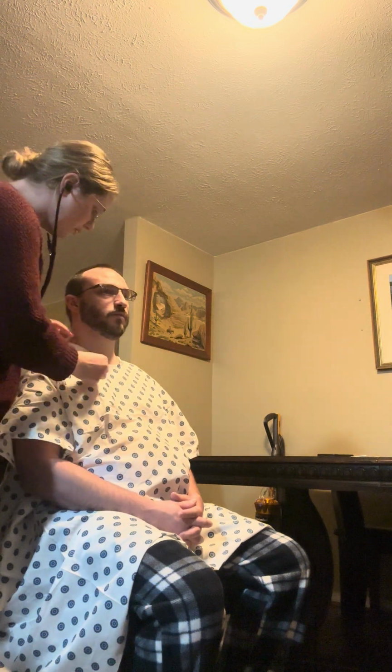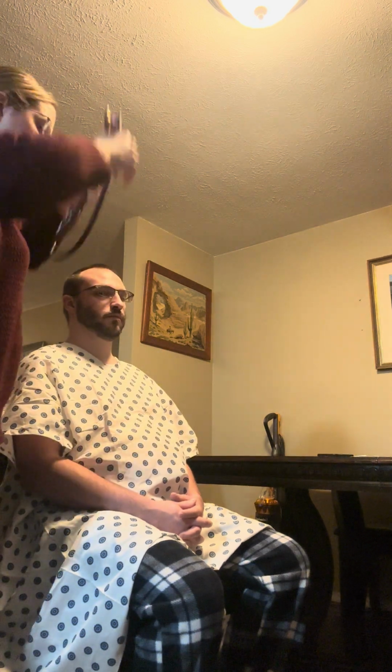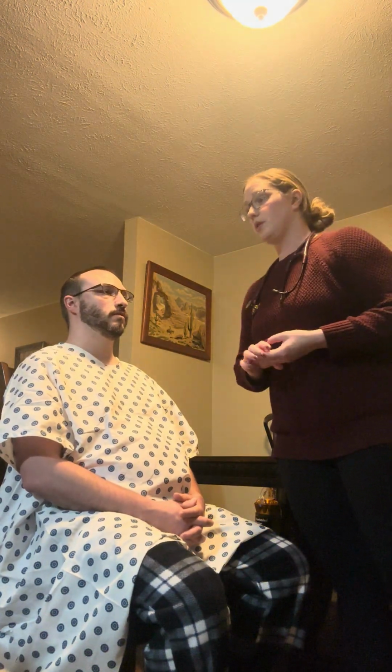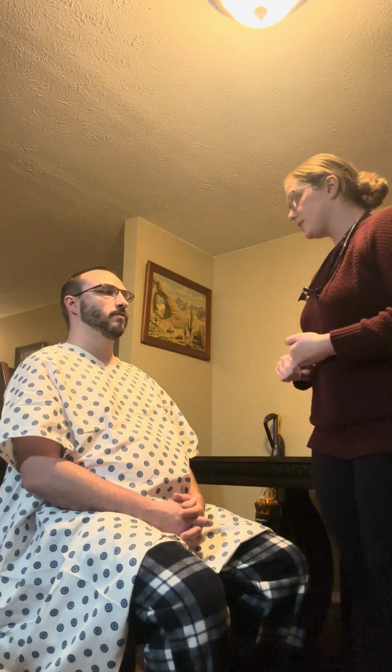Okay, and then I'm going to use the bell of my stethoscope and listen in all of those areas. And S1 and S2 are noted. There was no gallops, murmurs, rubs, or any extra heart sounds.